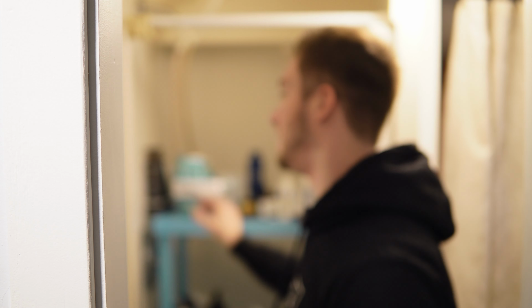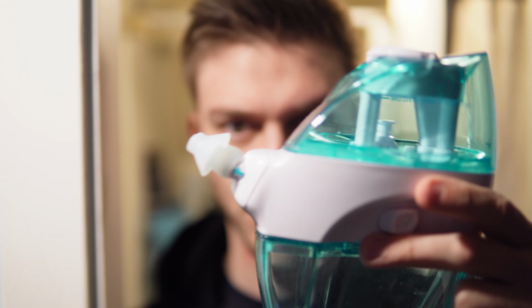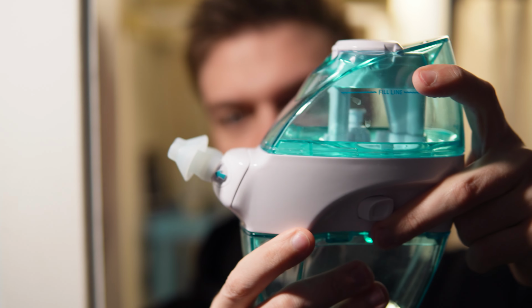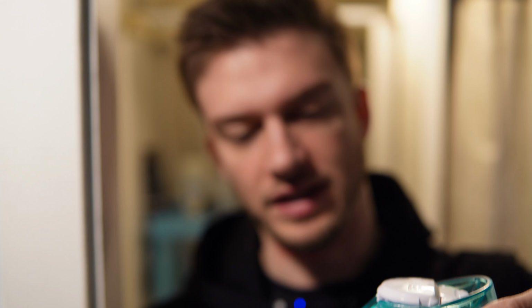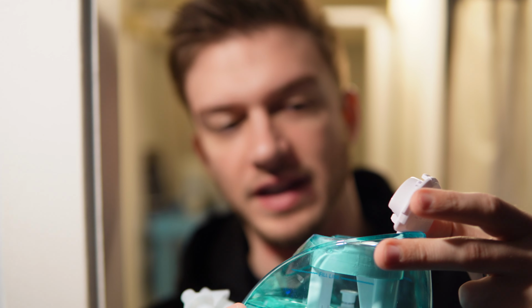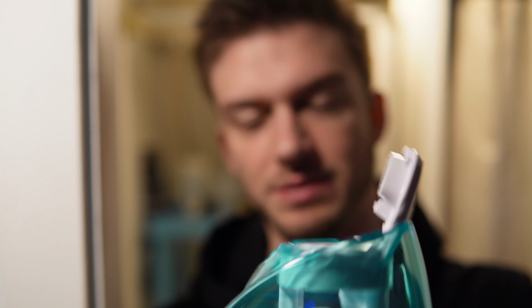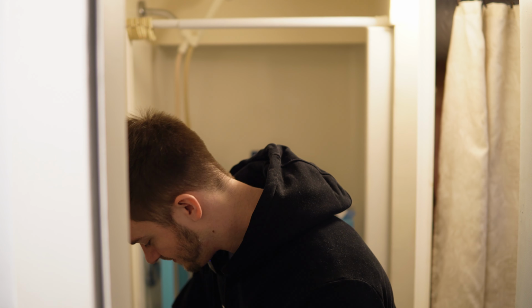So, you will require some distilled water in order to use this properly. This is the kit here. You can twist it to the side to pop that out for cleaning. I already cleaned this, and what you're going to do is pop the top off here, and there's a spot that you're supposed to rinse before and after each use. So we're going to go ahead and rinse that, and after it's rinsed out, the next step is putting the pod into that area, but we've got to fill this up with distilled water.